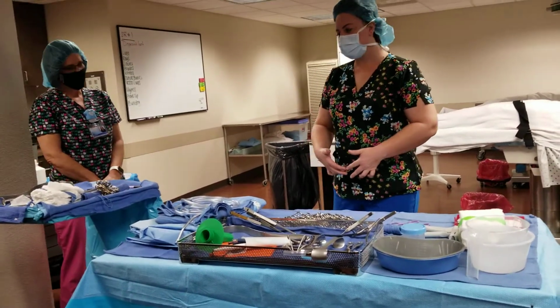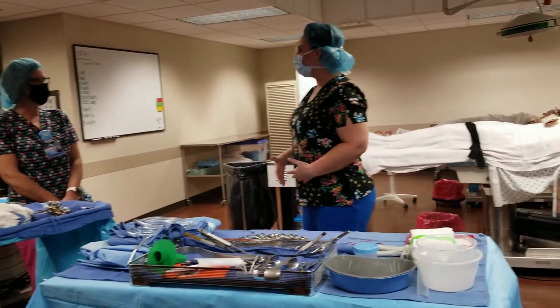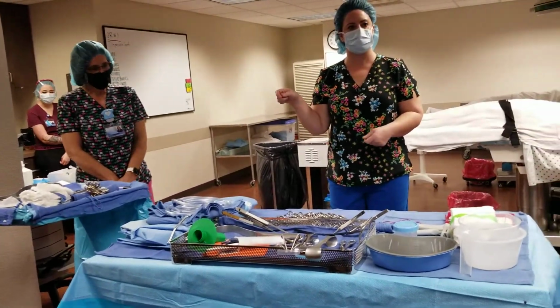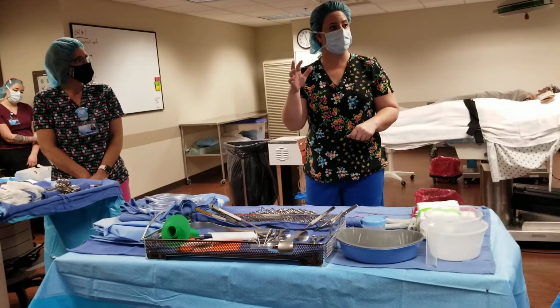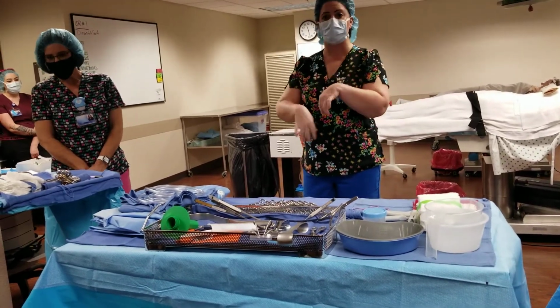All right, so what incision do we make? Good job, Pfannenstiel incision. Depending on how much of an emergency it is, they just might use a scalpel all the way down through. But if not, it's the regular process of getting into the abdomen. The knife, the bovie down through the fat.